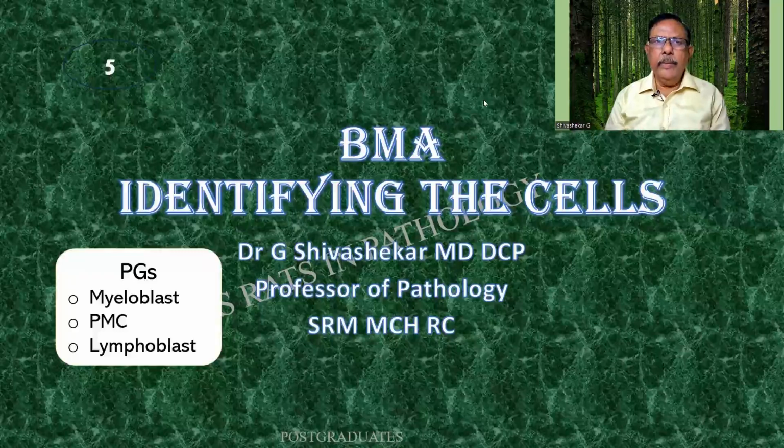A very good day, my dear postgraduate students. I shall be continuing with my classes on bone marrow aspiration. And today's class is identifying some cells such as the myeloblast, the lymphoblast, and the promyelocyte.